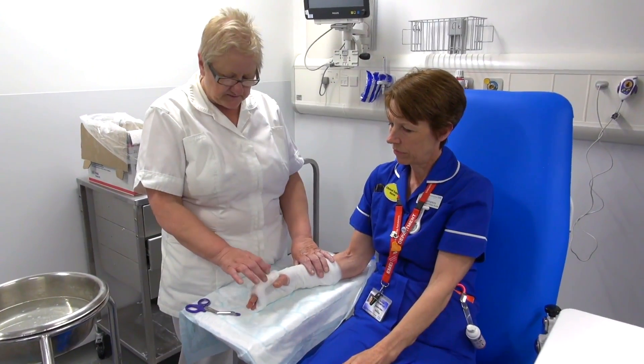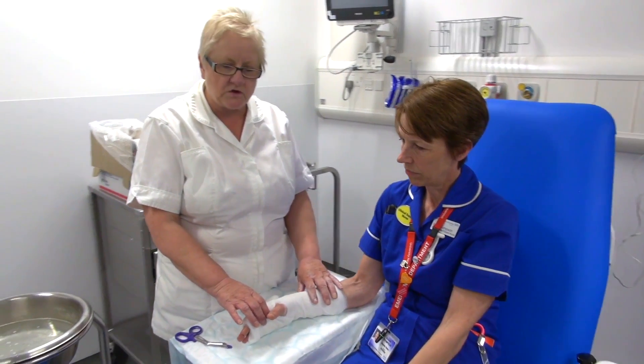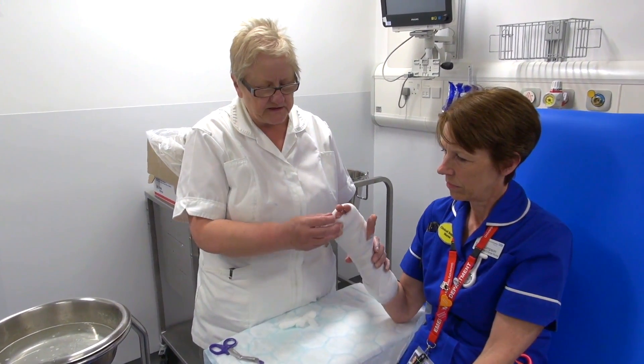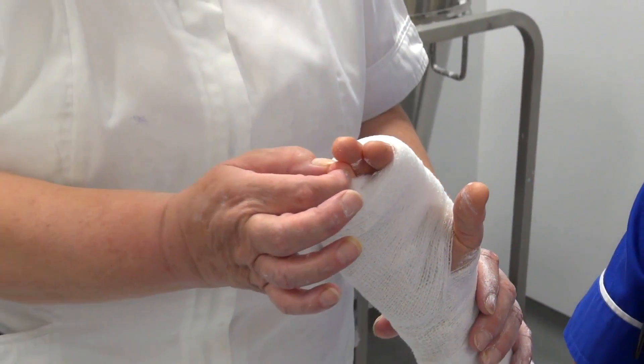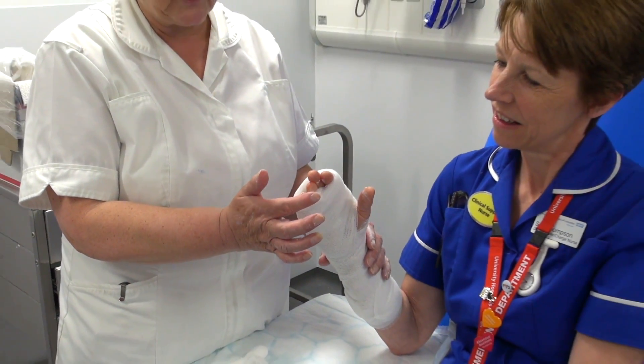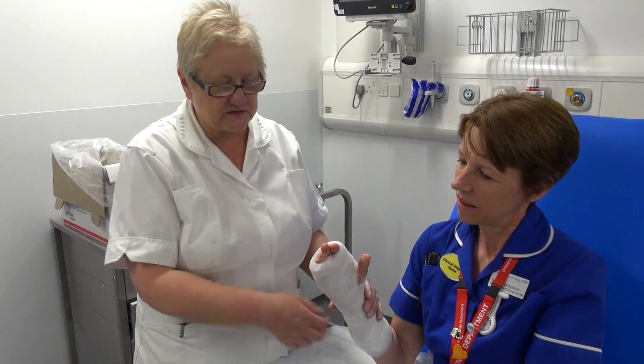Before you put this plaster on, you need to make sure there's no jewellery, no rings, no bracelets, no watches. Once it's on, you need to check the capillary refill — so you press for five seconds, take it off, and it should come back gradually, instantly. In two seconds it should be all back to normal.